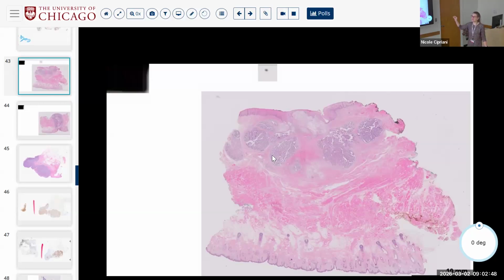If you find the AKT1 mutation, no, it's primary, because I don't believe prostate has that mutation. So exclude that the patient has a primary prostate cancer and/or include the presence of the AKT mutation, and that'll be diagnostic. But yeah, these are PSAP negative.